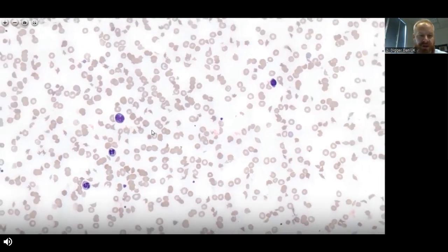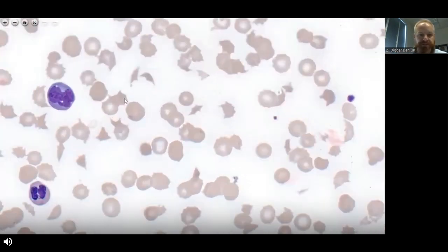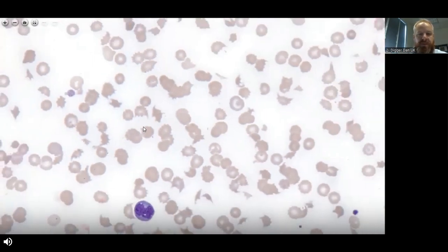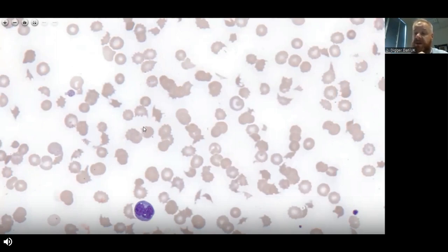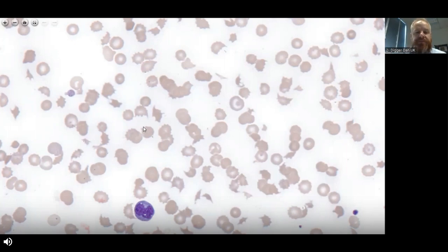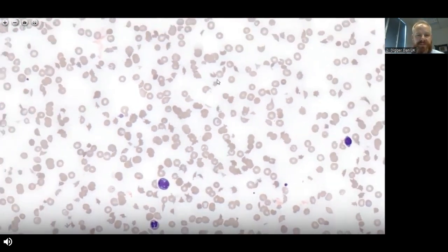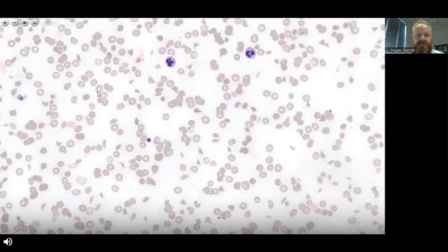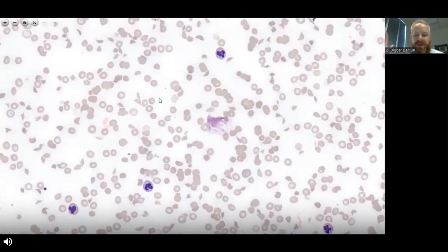I would estimate the platelet count in this patient to be less than 20. It is interesting that platelet count doesn't always correlate with bleeding phenotype — you can have a very high platelet count and a bleeding disorder because the platelets might be dysfunctional. It is not particularly usual for patients to bleed if their platelet count is above 50. Between 50 and 20 they may have some bleeding presentation, but patients really only start to present with a bleeding anomaly if their count is less than about 20–30.